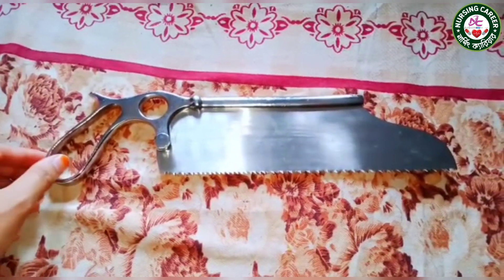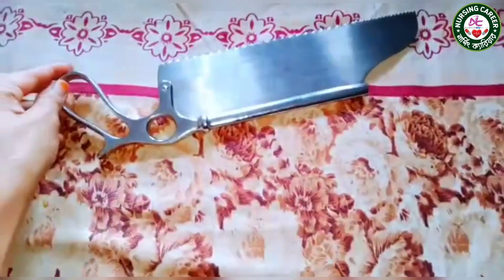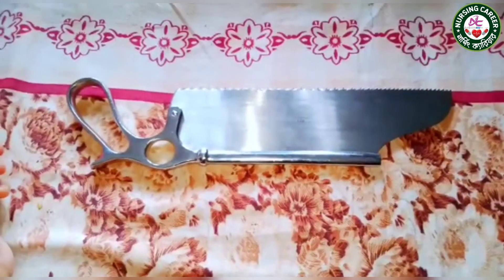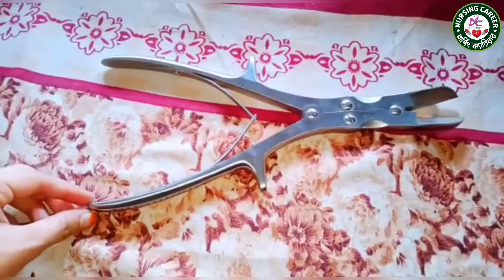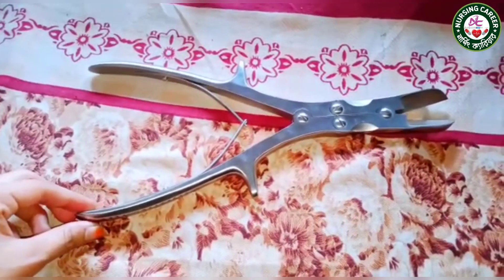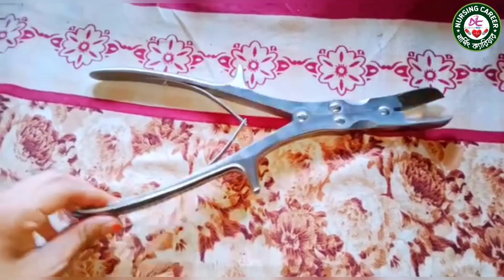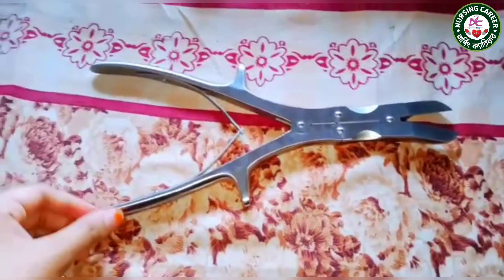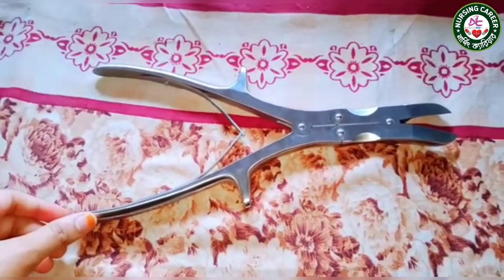This is a bone cutter, or bone cutting scissor. It is used to cut or remove bones.